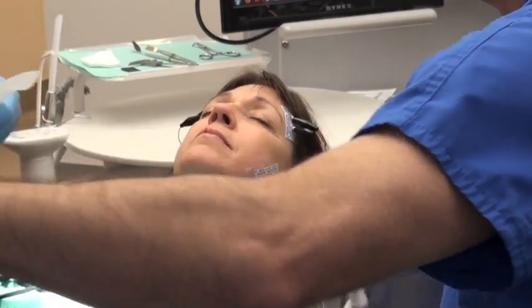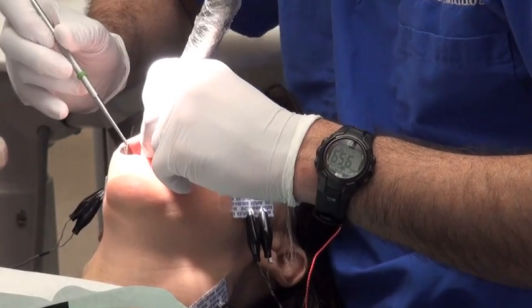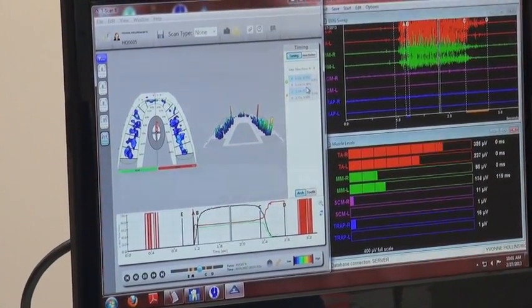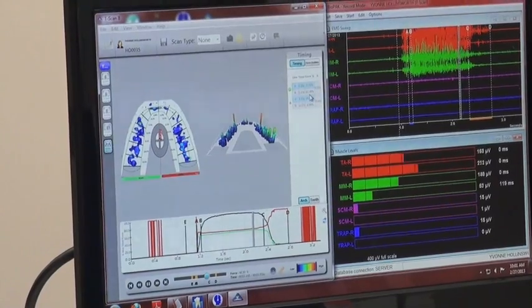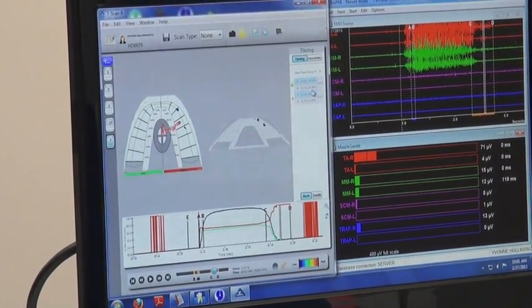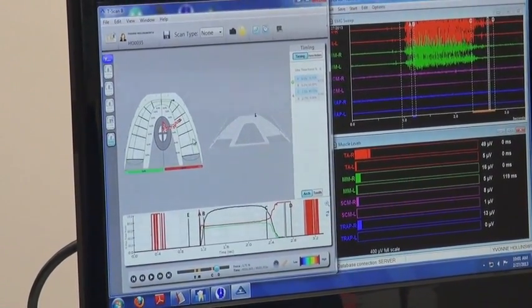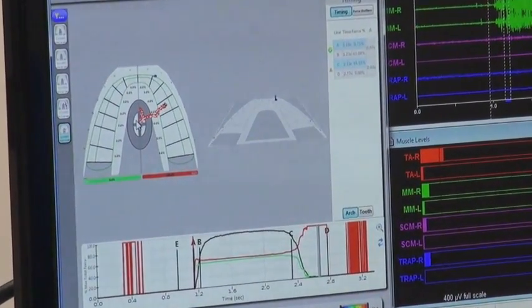So now I start doing the real precise adjustments based on the data. Actually, that's really quite good. Nice and centered. Starting to shoot towards number six — you see that? Remember the way the kite was squiggling back here in the beginning? Now it's shooting straight up to the canine. That's what we want. That's good enough for the right for now.